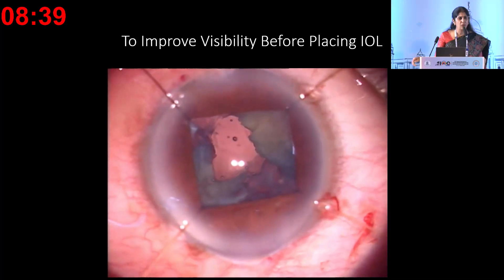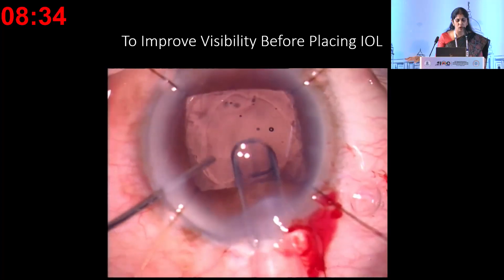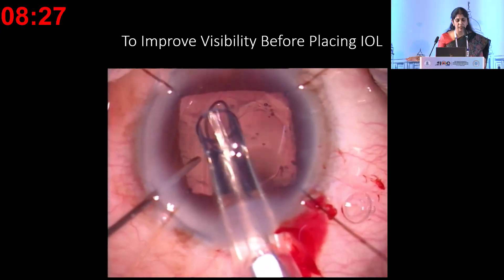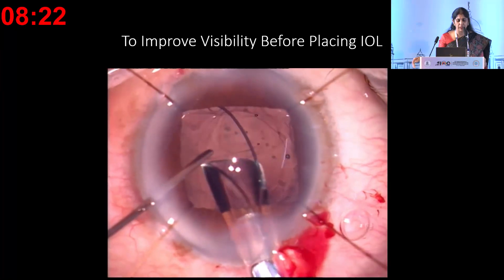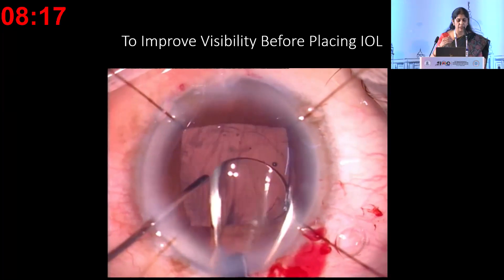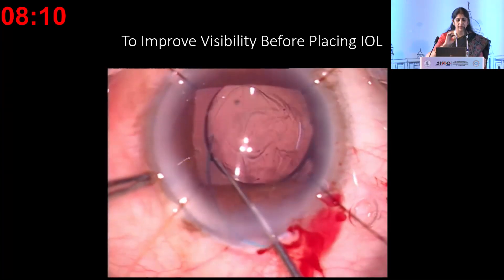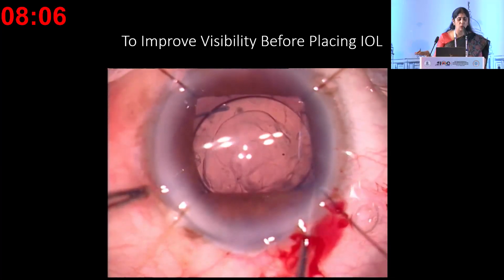Iris hooks are invaluable here—more so than in regular phaco. When you have a PC rupture, the pupil almost always comes down. Use the iris hooks once the vitreous is removed; this lifts the iris so you have enough space in the sulcus to place the IOL comfortably, and the anterior capsule rim is also well visible. In the sulcus, always use a three-piece lens. The leading haptic, when loaded, must be in a convex orientation—that way it goes comfortably into the sulcus, and then the trailing haptic is placed.